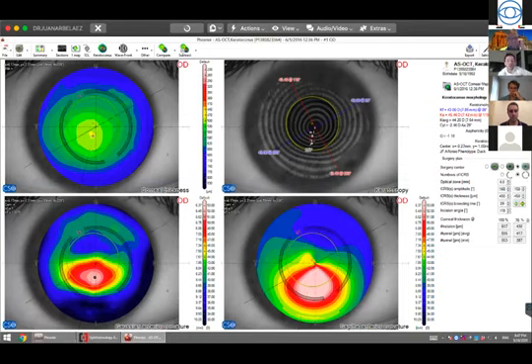It also allows you to see the possible axis of implantation, and you can play between the notable points, for example here, and the topographic axis, and decide where you are going to implant this ring. If you are not happy with these two options, you can still change them here by using the dissecting line, the line that is the middle of the ring, and it will give you the axis of incision to input in your femtosecond.